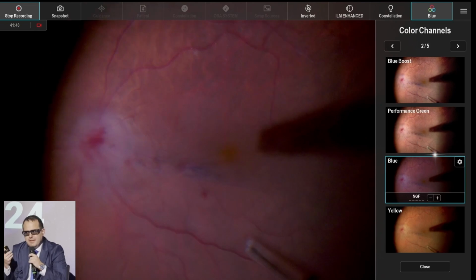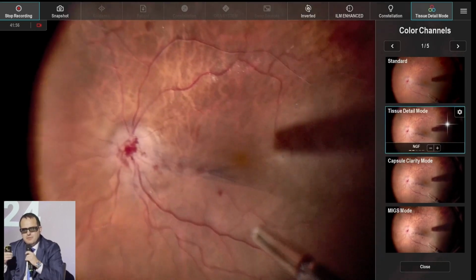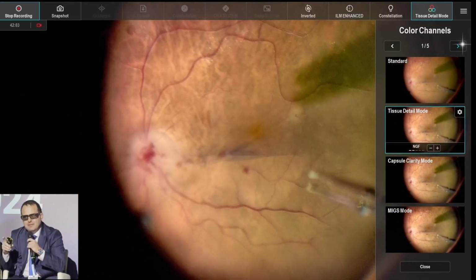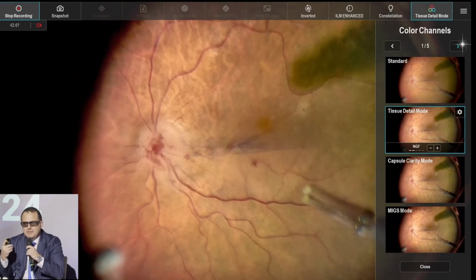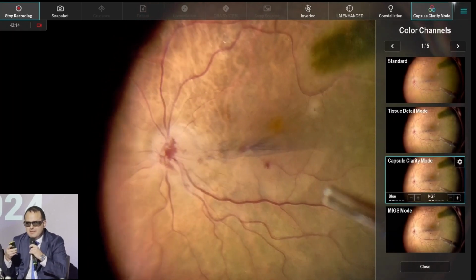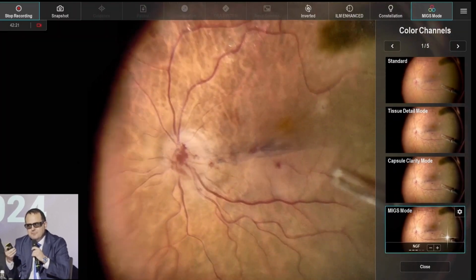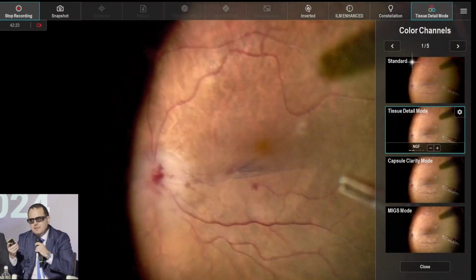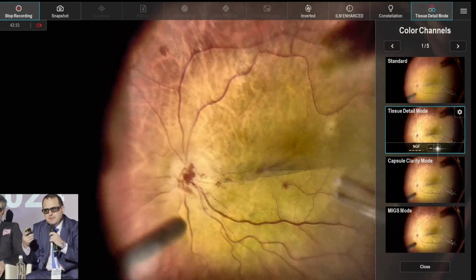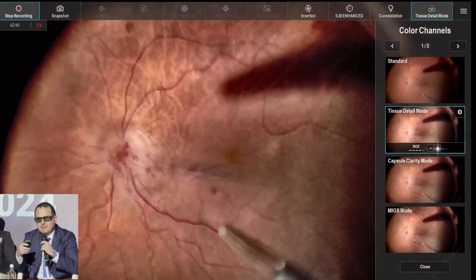We can also play again with the inbuilt filters, and I want to stress your attention over the NGF factor or Ngenuity factor. It is a stepwise approach of increasing the contrast and highlights in the image. And it can change how we see the stained tissues. And of course, if we see better, we will work more precisely. So you can see here changing the color modes and the intensity of the added modification. In that case, it is the Ngenuity factor. You can see now we can increase the contrast and we can increase or improve what we are seeing actually.